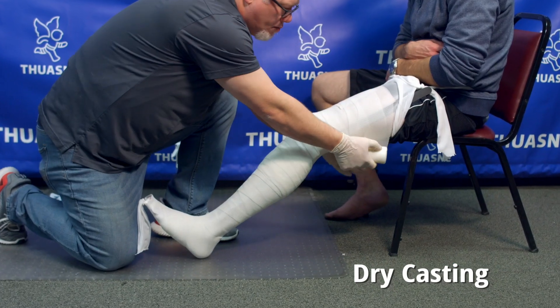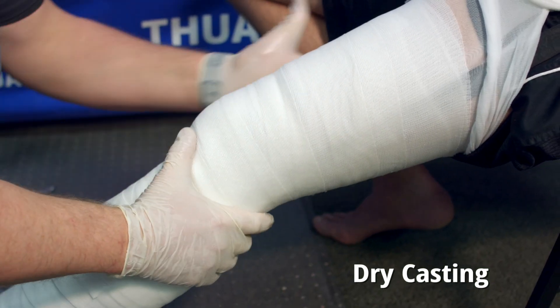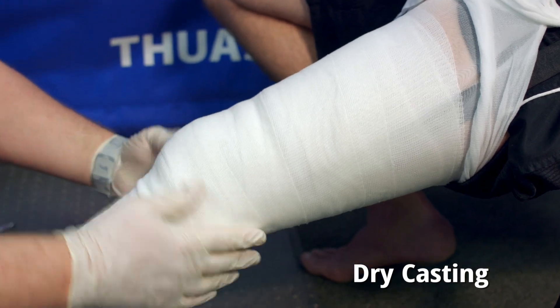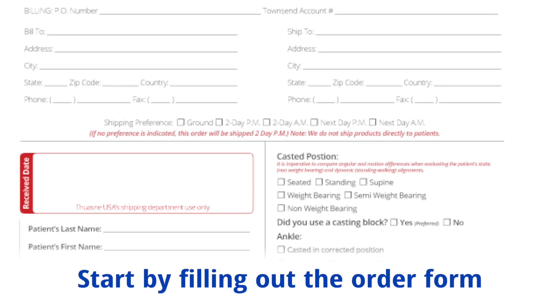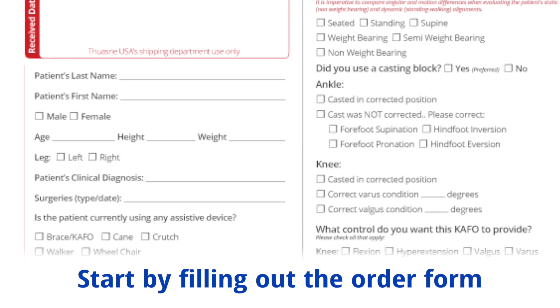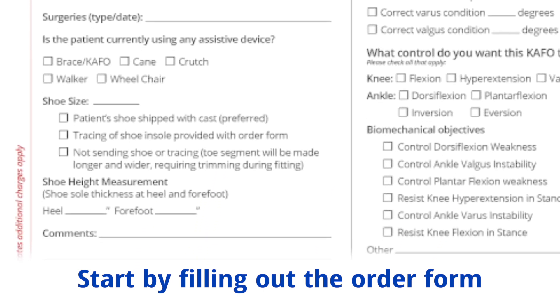The technique we are going to demonstrate is a dry casting technique. This technique allows you to have more time to adjust the patient position while the cast is curing. We recommend you start by filling out the order form, as your decisions on the brace fabrication may impact the cast you are taking in terms of the length and position.